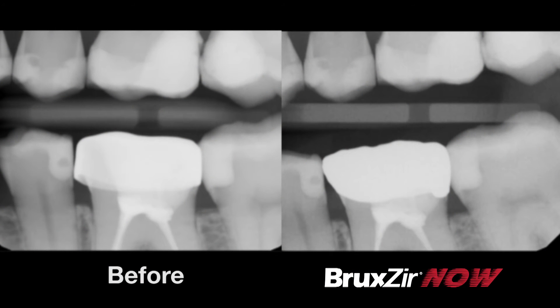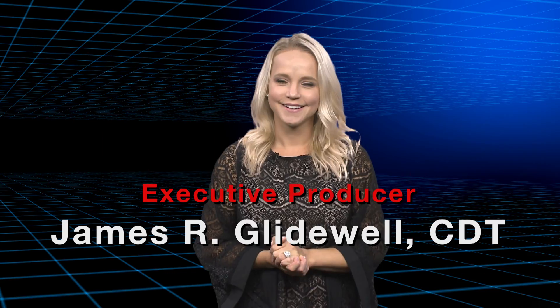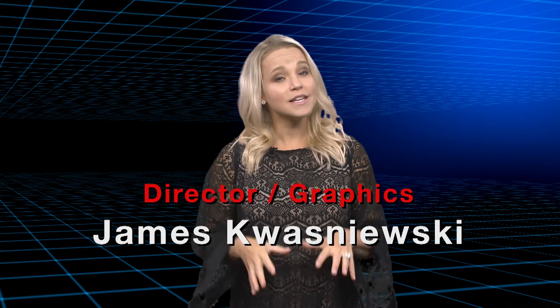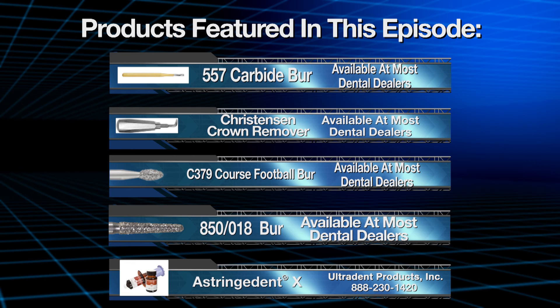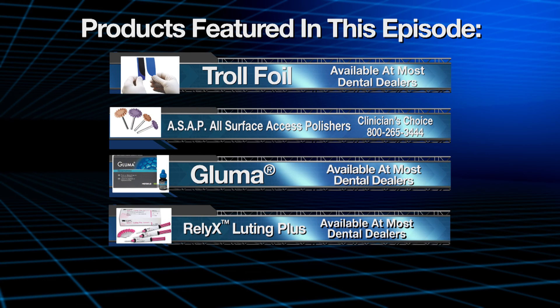From the buccal view of the old prep, we can see the occlusal surface of the prep is almost even with the occlusal table of the adjacent teeth. It'll be important to reduce this further to allow adequate room for our Bruxer crown. I begin refining the preparation on the occlusal using a coarse grit football diamond, with the tip slightly angled downward to ensure the central fossa area is deeper to allow for more natural contours of the crown. On the axial surfaces, I use a coarse grit 850-018 burr to establish a one millimeter chamfer margin. With a periodontal probe angled toward the tooth with light apical pressure, I trace along the margins circumferentially around the tooth to verify adequate reduction and that it's smooth and continuous.